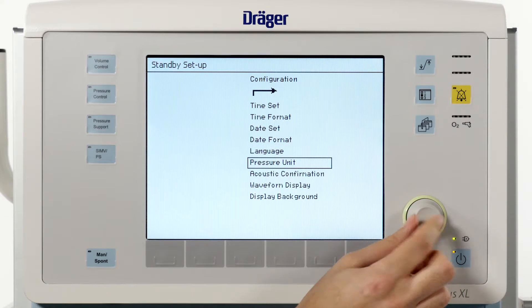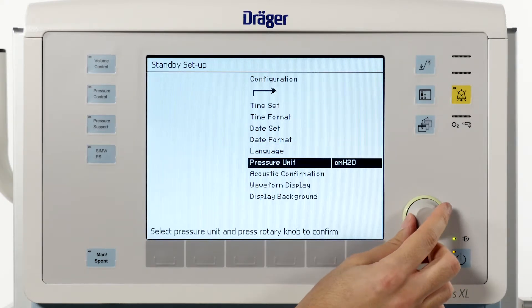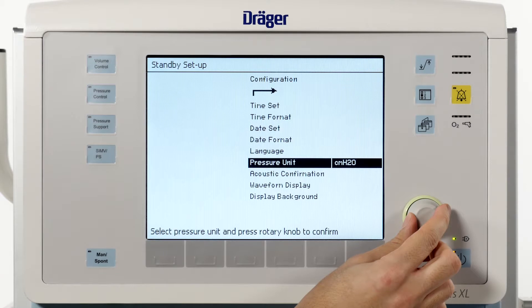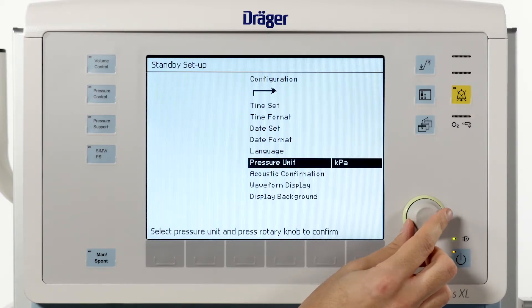The menu point pressure unit allows you to select the units of pressure measurement. You can choose between centimeters of water, millibar, hectopascal, and kilopascal.